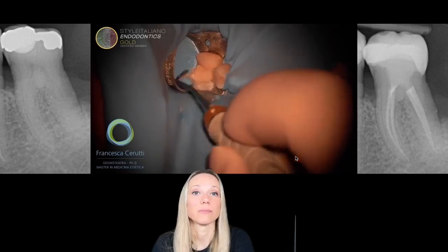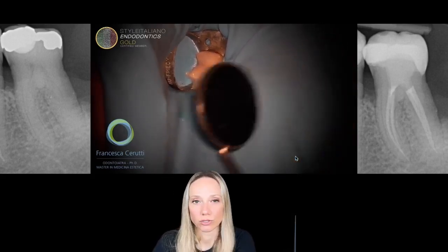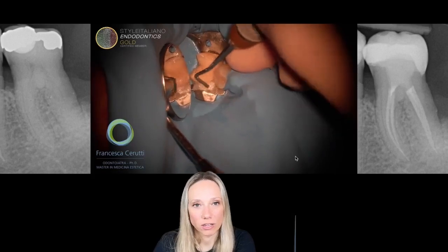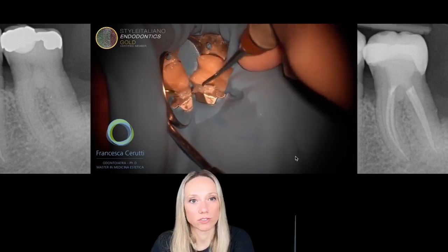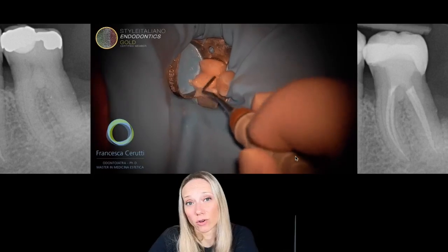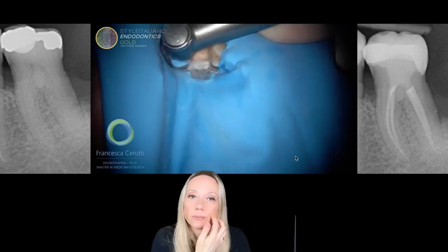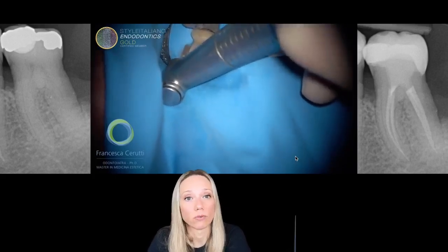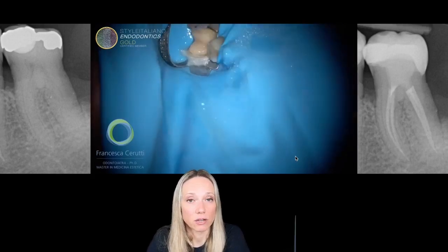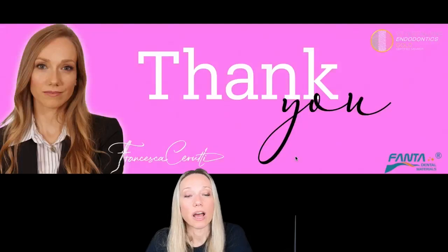So I'm going to take immediately the scan for my laboratory to produce the composite onlay or overlay. Because I want to save time, I don't want to put a provisional restoration because there's a bigger risk of coronal leakage then. So I do immediately the composite. And then I do my preparation. And so you see that it's a 2 hours workflow, 1 hour and a half, it depends on how fast you are. It's worth it. Okay? So I hope you enjoyed the lecture, and if you have any question, I'm here to answer.